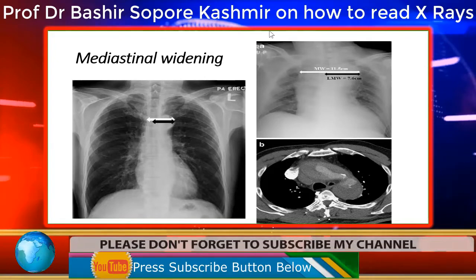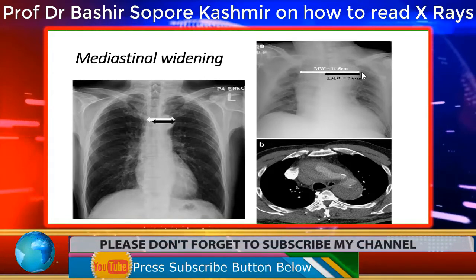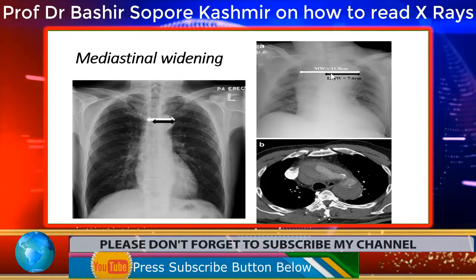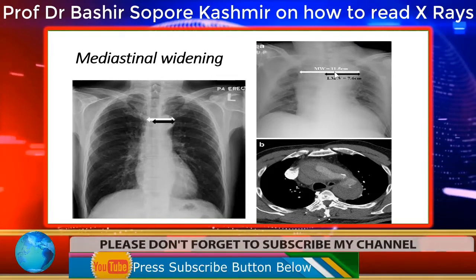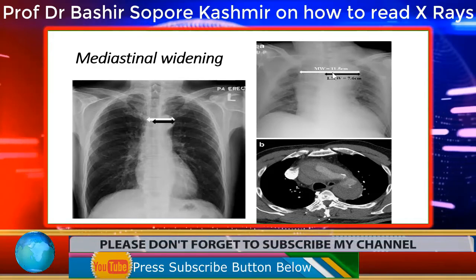So you can see here, when we measure from this point to this point, right? It is around 11.5 centimeters. So it is more than 8 centimeters. So we can say that here the mediastinum is enlarged.